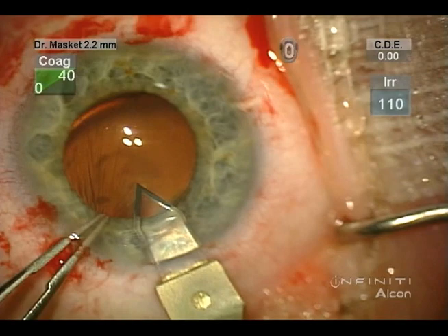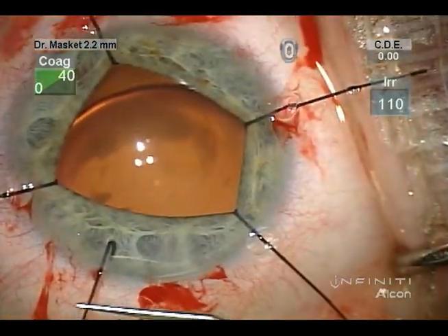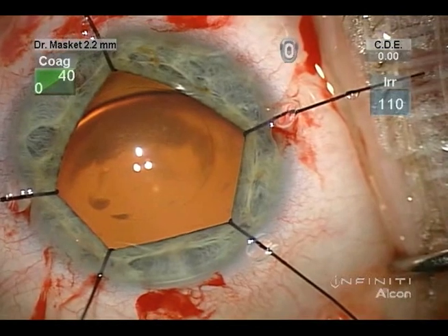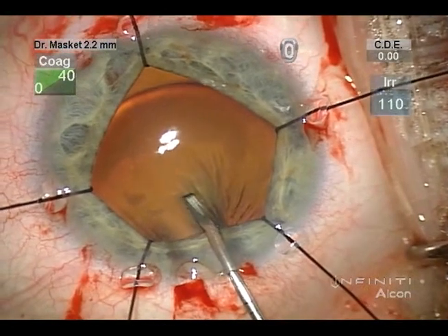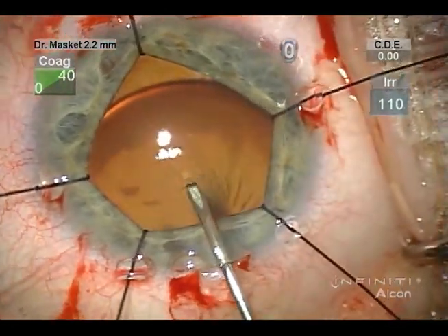The chamber is entered temporally with a 2.2 diamond blade and OVD is instilled into the chamber. Five disposable iris hooks are positioned in a pentagonal fashion to expose the lens, and the capsulotomy is initiated with a very sharp cystitome, necessary in subluxated lenses.